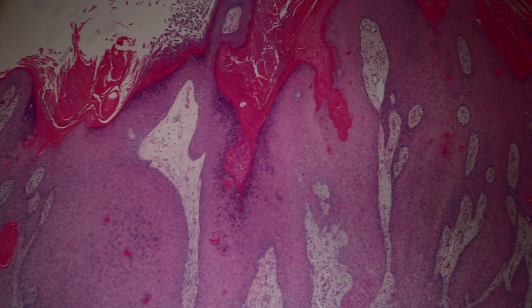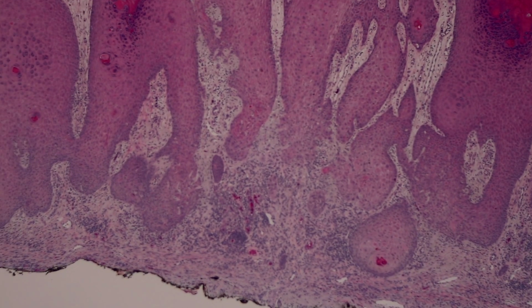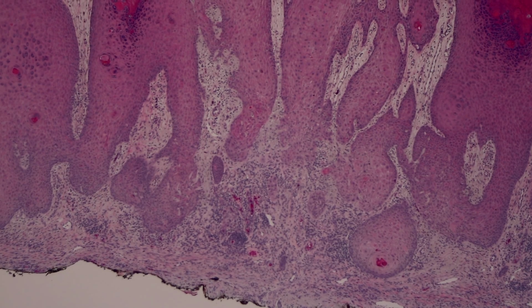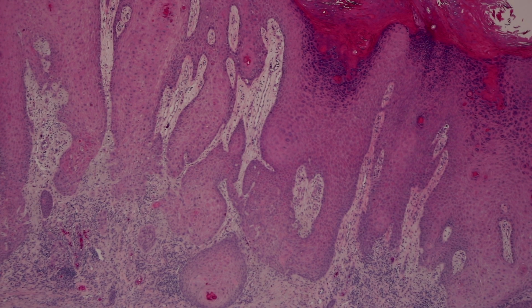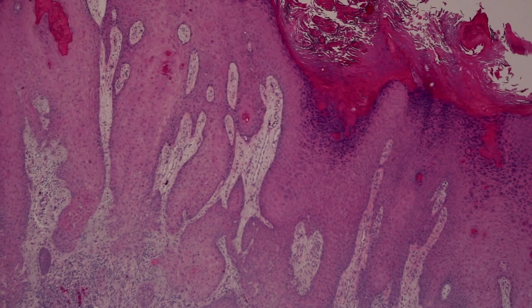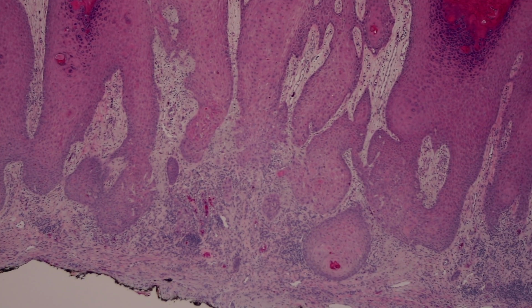But then look what happens as you go deeper. Obvious squamous cell carcinoma. Now, is this a wart that turned into a squame? I don't know, maybe so. But I see things that look warty on top and actually down at the base have squamous cell carcinoma. I see that regularly. So the rule that I've learned, just like with cysts, particularly in the dorsal hand and forearm area in sun-damaged regions, is that I'm really concerned about making a diagnosis of verruca in old sun-damaged people on the dorsal hand and forearm, particularly if I can't see the base of the lesion.